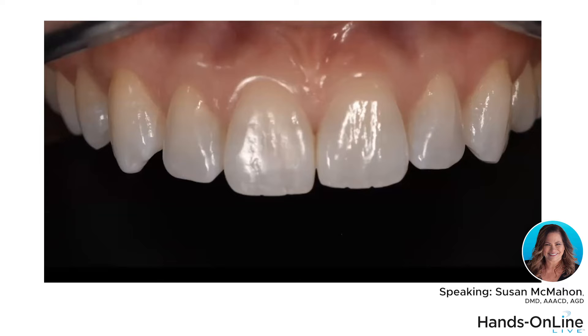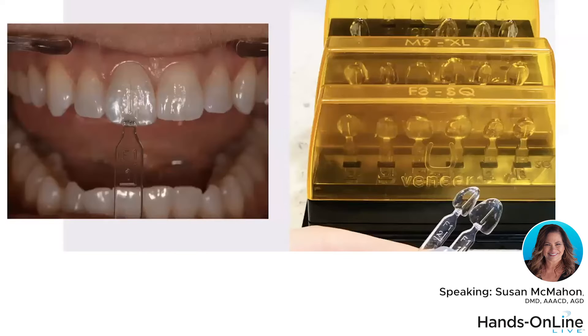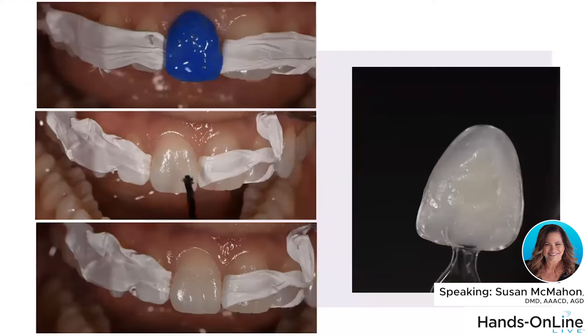So she's a great candidate for no-prep direct composite veneers. This kit is called YouVeneer — it's a template kit with autoclavable templates. The extended kit has surface texture built into it, and I love the way it turns out. It's pretty simple to use: you select a size — it comes in four sizes — choosing the one with the best marginal adaptation and the best mesial-distal width, then you isolate one tooth at a time.